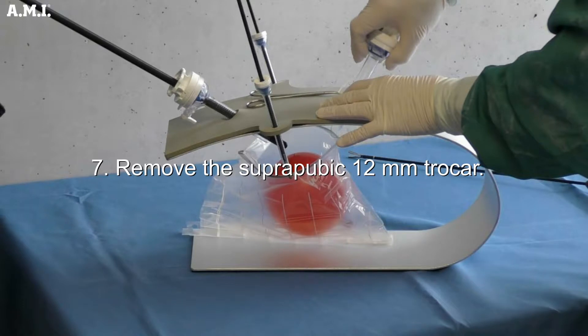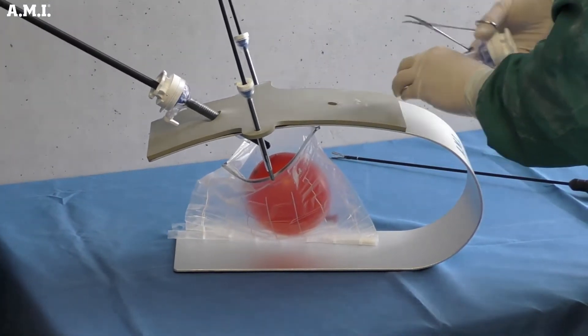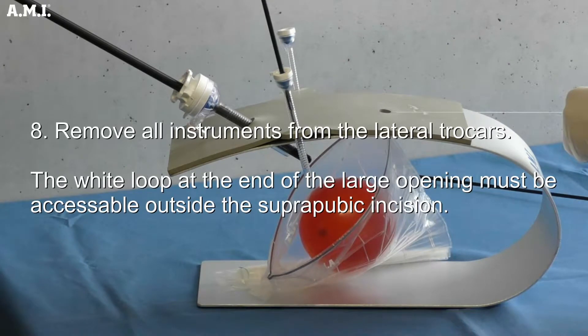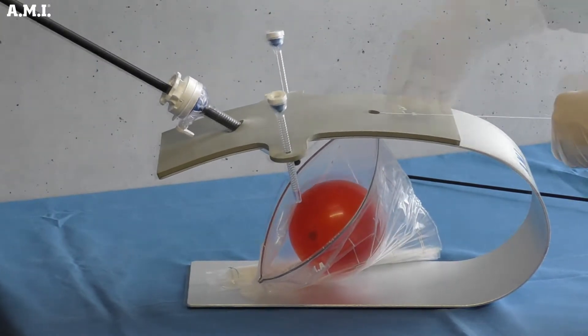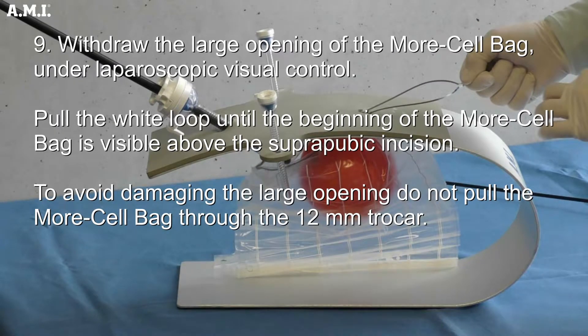Remove the suprapubic 12 mm trocar. Remove all instruments from the lateral trocars. The white loop at the end of the large opening must be accessible outside of the suprapubic incision. Withdraw the large opening of the More-Cell Bag under laparoscopic visual control, then pull the white loop until the beginning of the More-Cell Bag is visible above the suprapubic incision. To avoid damaging the large opening, do not pull the More-Cell Bag through the 12 mm trocar.